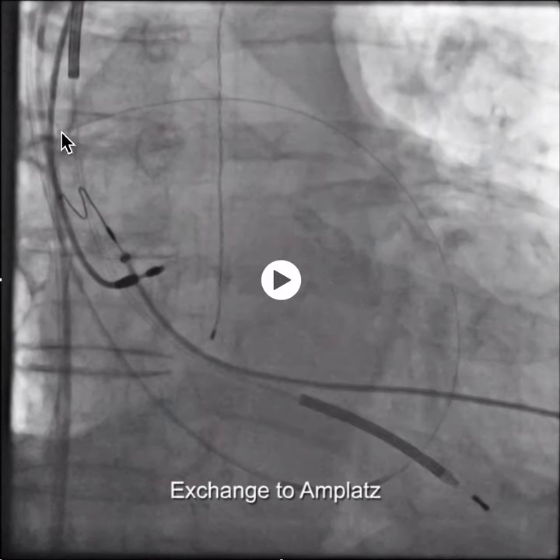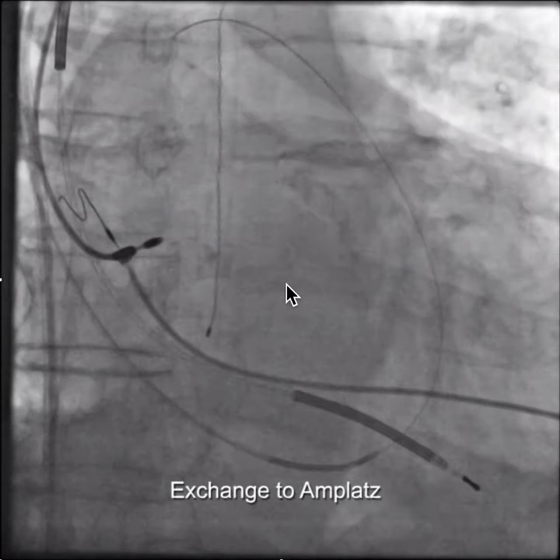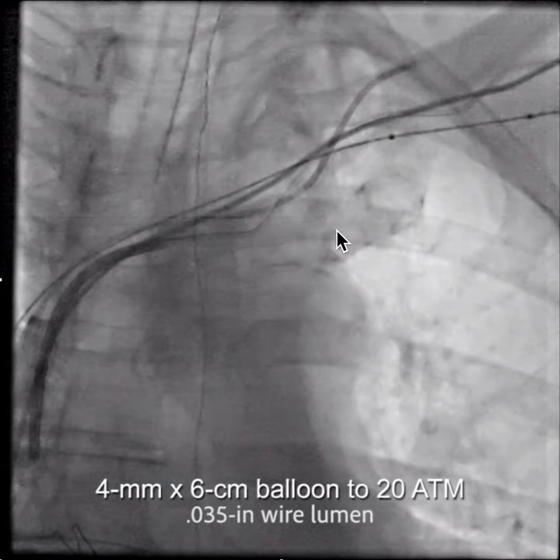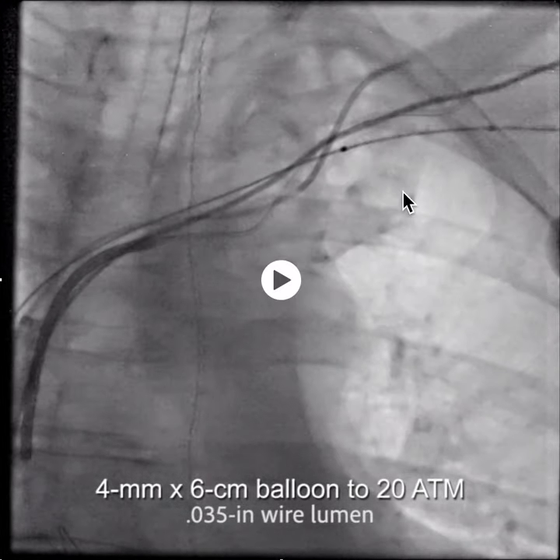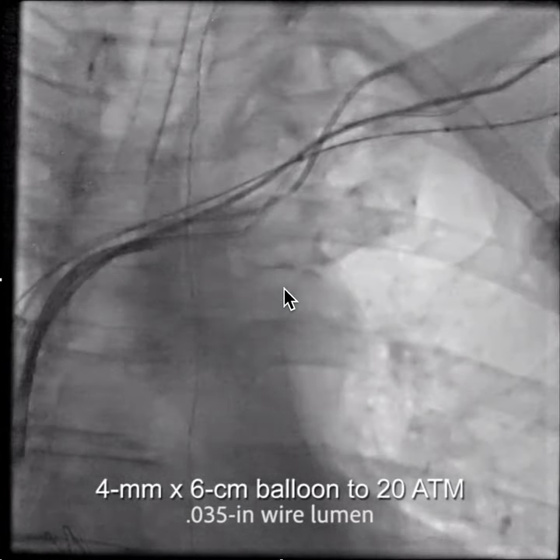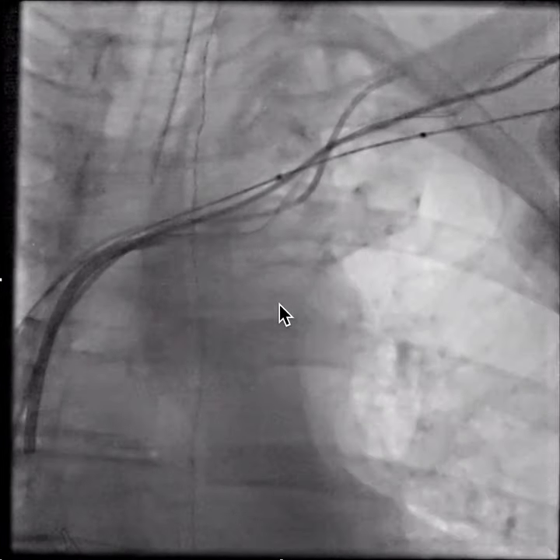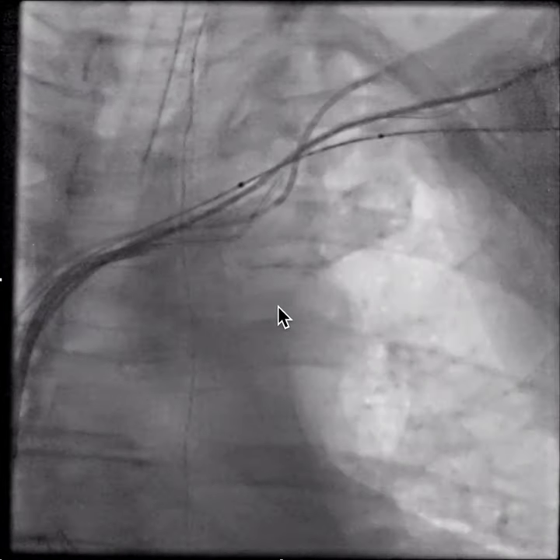You can see now we have the V18 control wire. We're exchanging it from an .018 wire to an .035 wire, and over that wire we're putting a balloon — but we're having great difficulty getting the balloon to advance over the .035 wire.